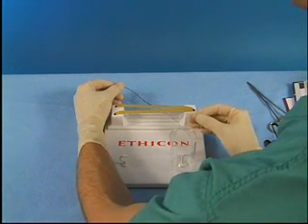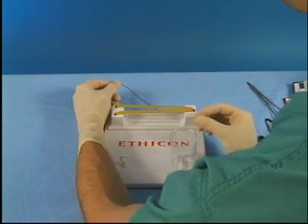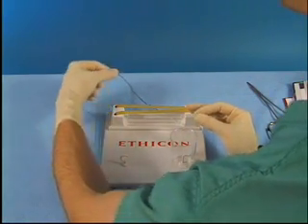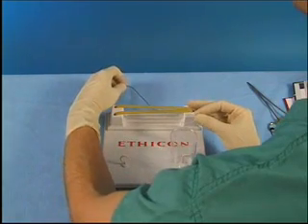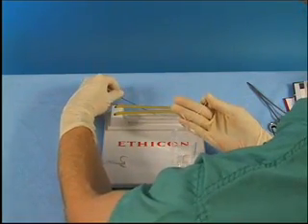To perform a one-handed tie using the right hand, the shorter end of the suture material is placed near the surgeon and held in the right hand between the index finger and thumb. The longer end of the suture material is placed away from the surgeon and is held in the left hand. The 3 fingers of the right hand are rotated and flipped under the suture material.